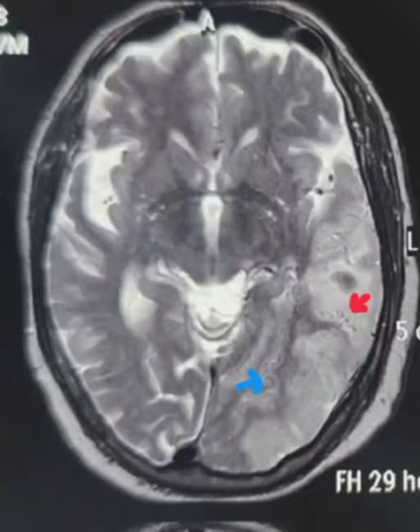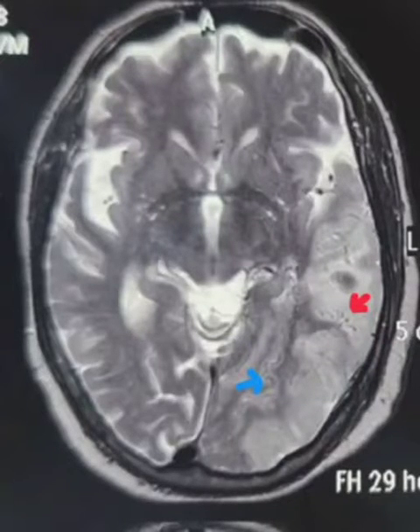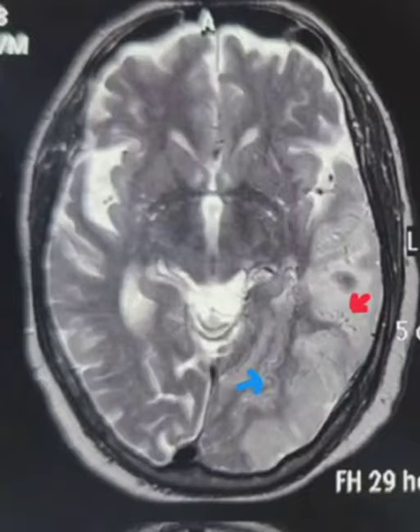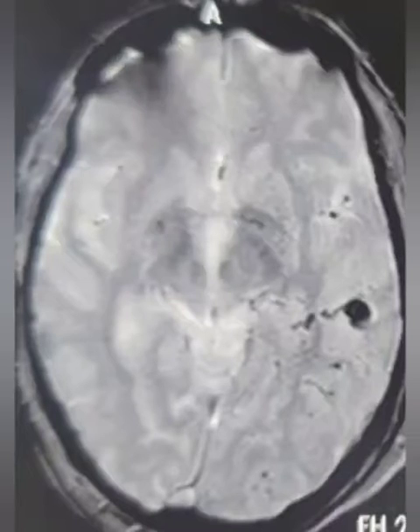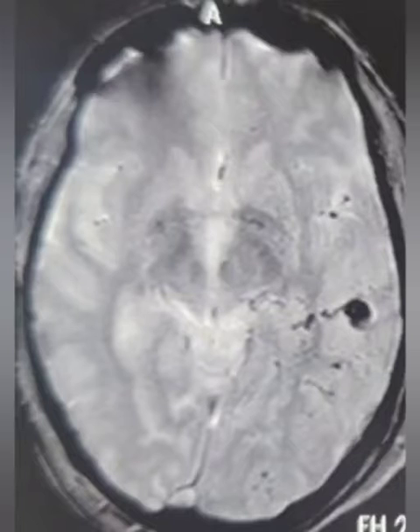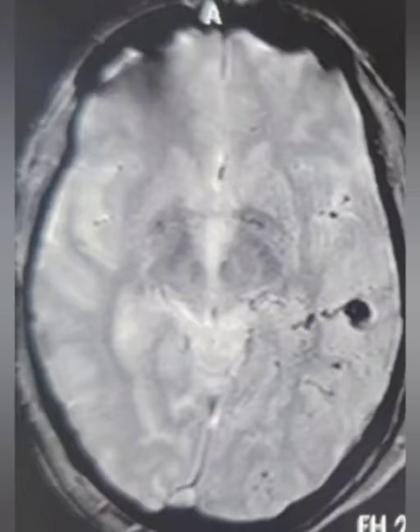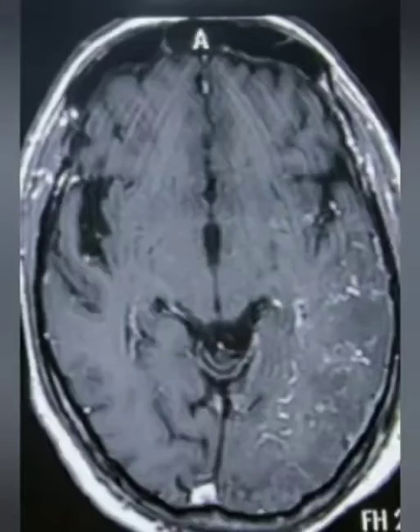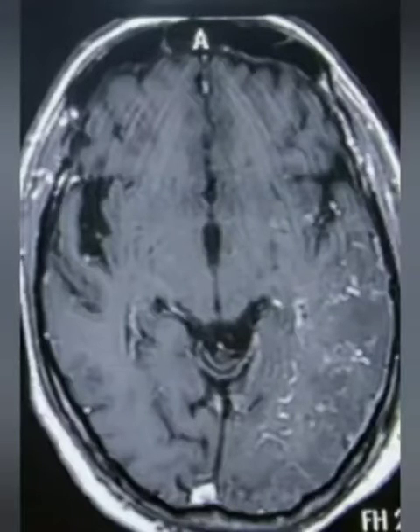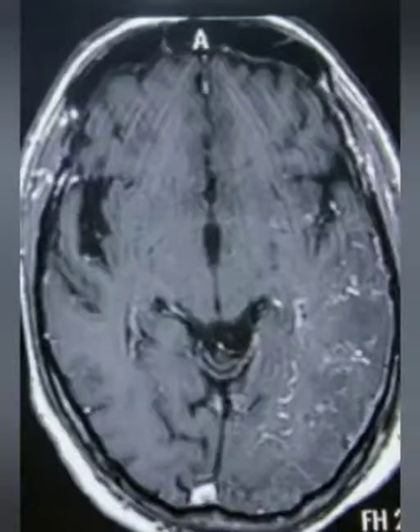This gentleman presented with progressive memory impairment. Axial T2 MRI and SWI images show dilated tortuous cortical veins, which was again witnessed on post-contrast T1 imaging. This raised the possibility of dural arteriovenous malformation.